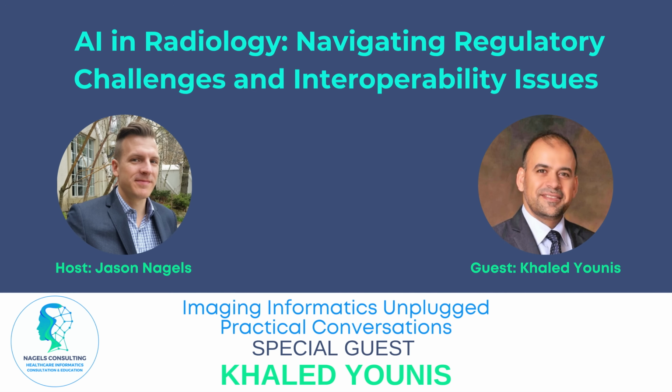And instead of the data moving, which can also be expensive, now federated learning is one type of a larger category called collaborative learning, where instead of sharing the data, we just connect to a central hub. We call it the federated learning server, and that server administers the sharing of the model parameter updates among the different clients.